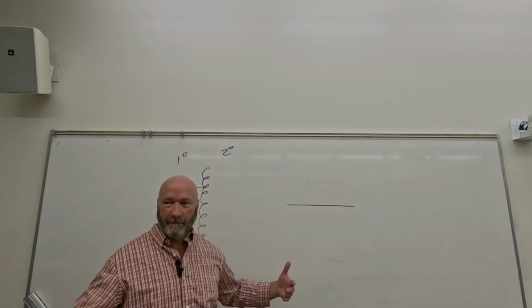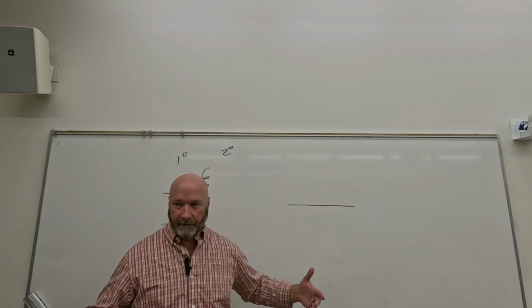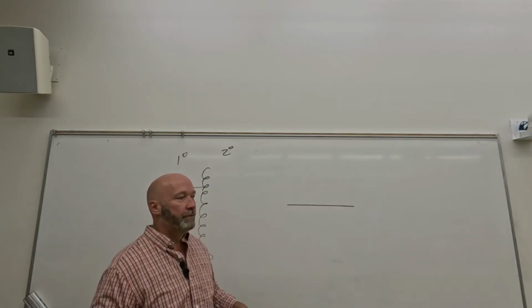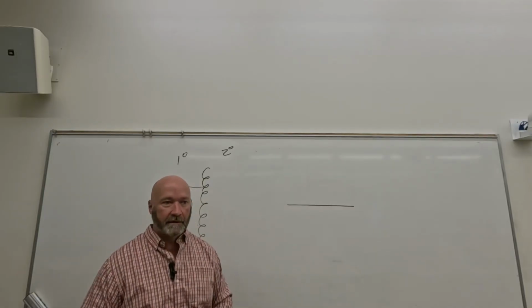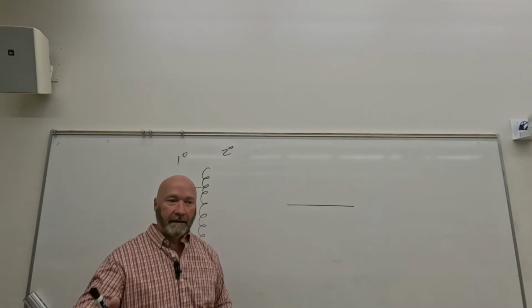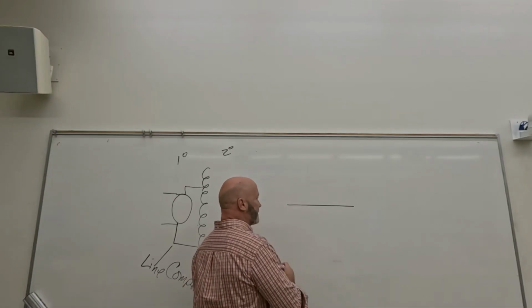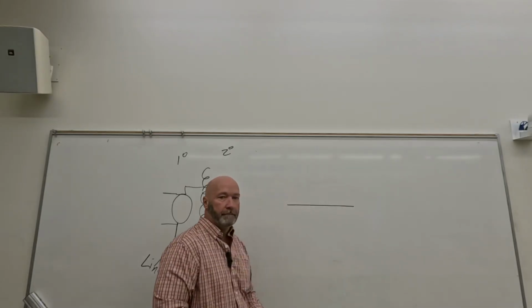So some may be plastic, but most of them are going to be carbon fiber. But they're relatively large, right? So they have to have some sort of support system. Some of y'all have lab today. Take a look at the tabletop in lab, and what you're going to see is a flat tabletop.